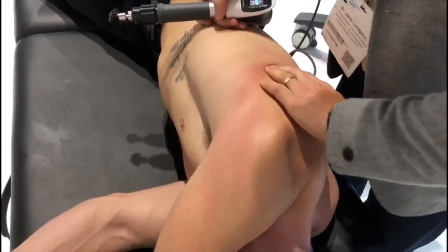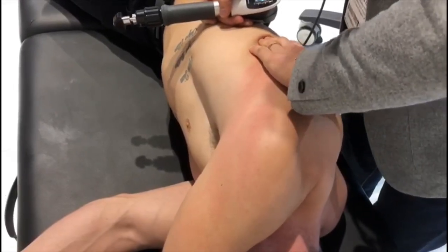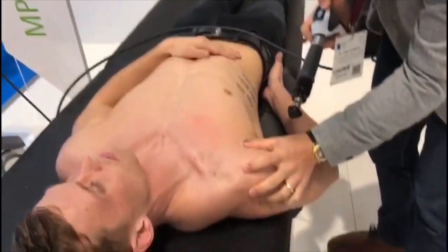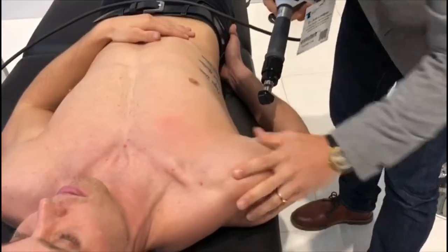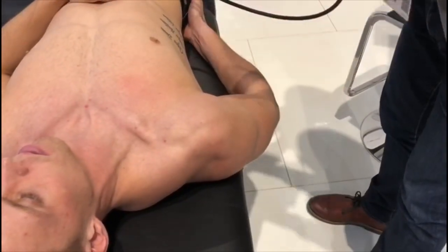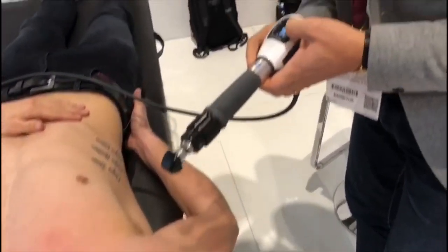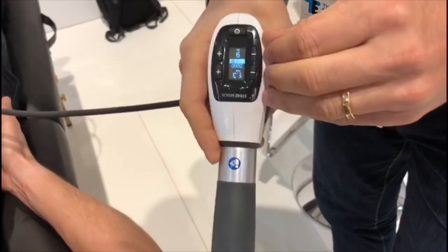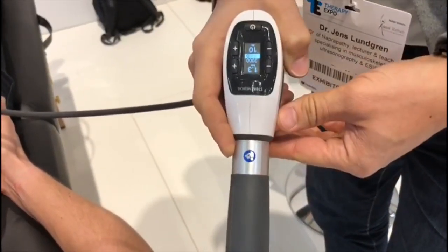I'll probably work here, but I'll work 90 degrees to the fibers like this. Let's try to work in this fascia here, which is obviously a little bit tense. Oh, sorry. Lower frequency, lower the energy to 1.3. I reset the counting system, so like that. That's a good setting.